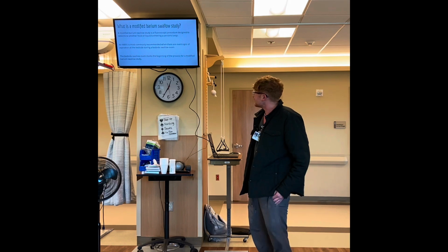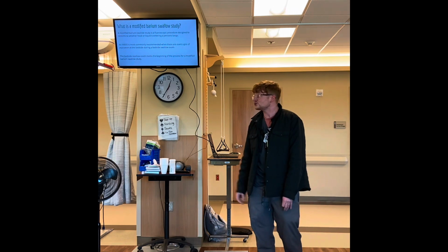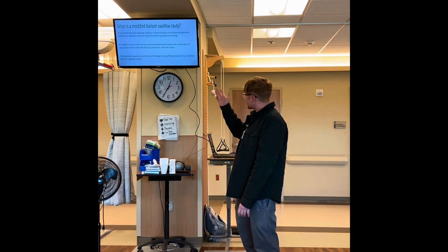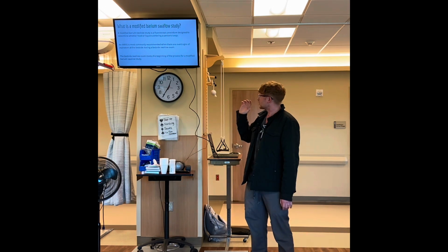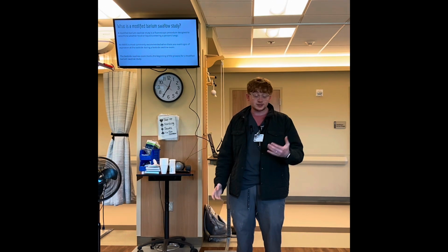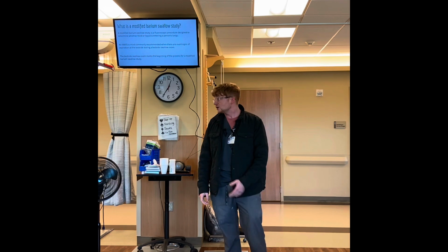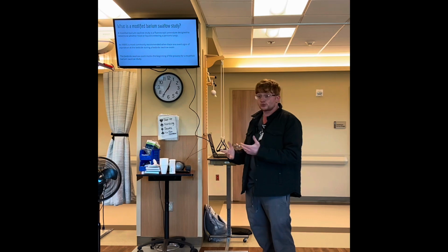What is a Modified Barium Swallow Study? This is the fluoroscopic imaging procedure that we use down in radiology. We have the patient come in and we visualize their swallow. The main reason that we recommend one is if there are overt signs of aspiration at the bedside during a bedside swallow eval. The bedside swallow is just when we go in, we have our water, our thickened liquid, our pudding and cracker, and we're looking for coughing, throat clearing, watery eyes, anything overt that would lead us to believe that aspiration is occurring.